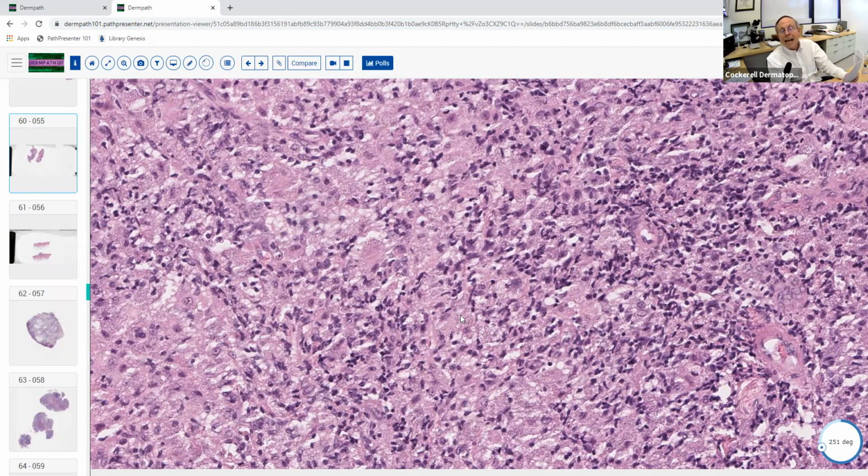Eating street food in Bangkok. So what are they asking for there? Penicillium marneffii, endemic in Thailand. Okay, HIV positive patients get that condition. Swimming in a Texas lake in the summer. They're asking about acanthamoeba infection. Well, these are way, way too small for amoeba. Amoeba are pretty large. You also see erythrophagocytosis in some of those things. They're much bigger than you see here. So this is obviously not amoeba.